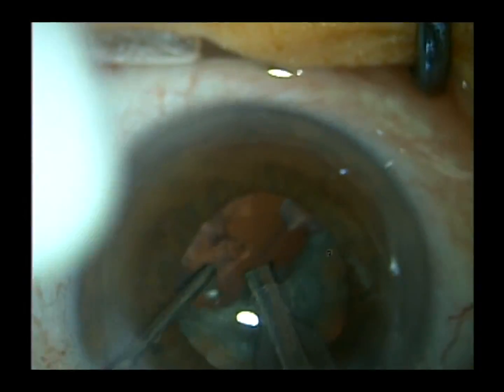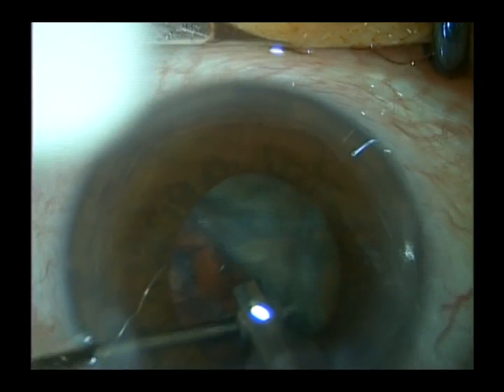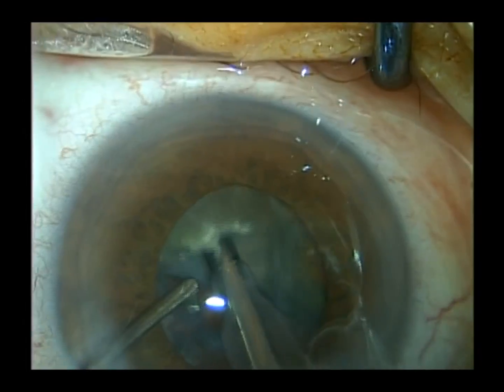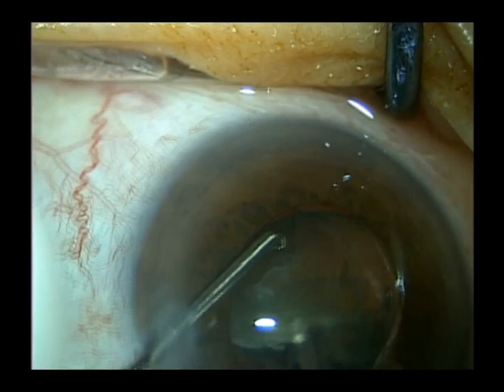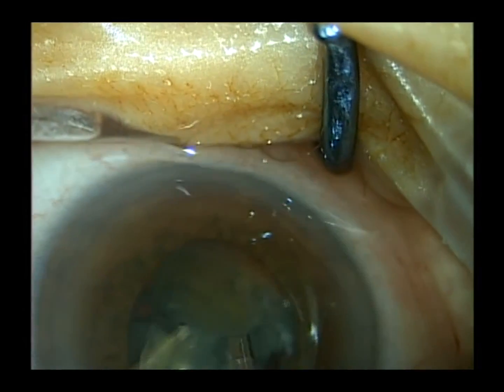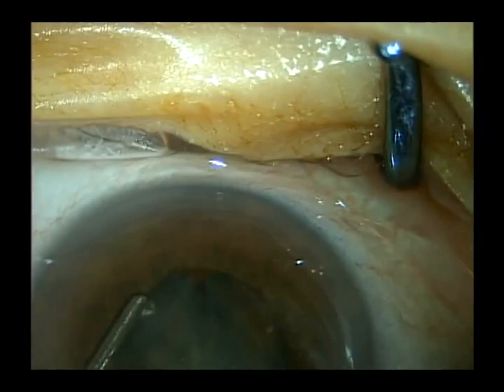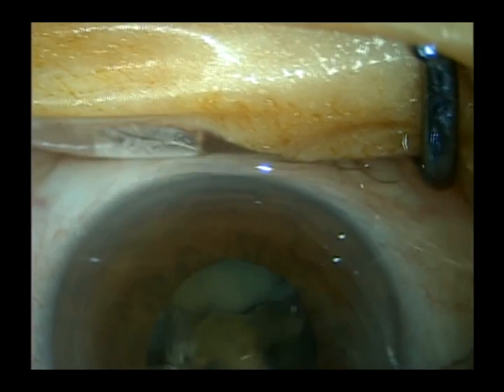So here I've taken out now half the lens, and I have one half of the lens, which I'll spin around, and I'll try to just chop it. Again, I'll bring this half toward the middle by lollipopping it. I'll be careful to make sure that my second instrument does not engage the anterior capsule leaflet. I'll chop it into several pieces to make it easy on myself, and then just emulsify it.